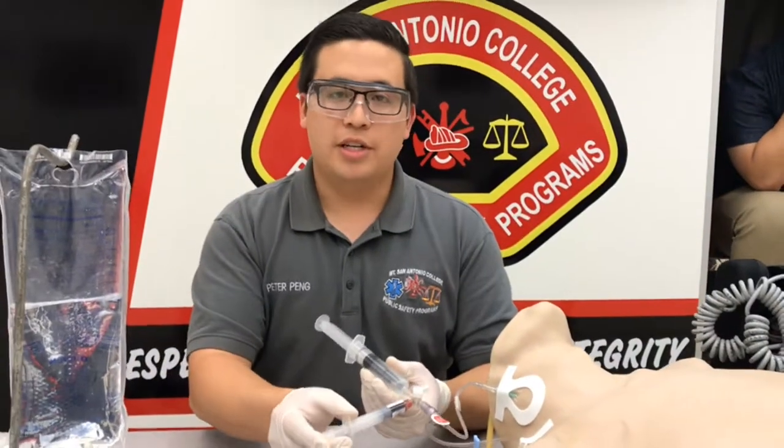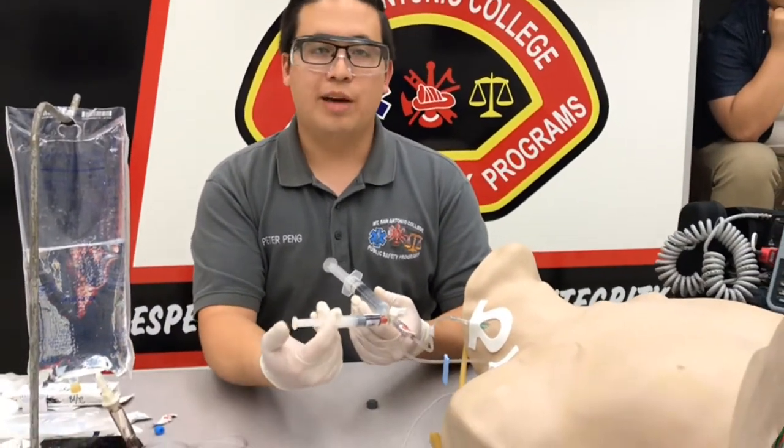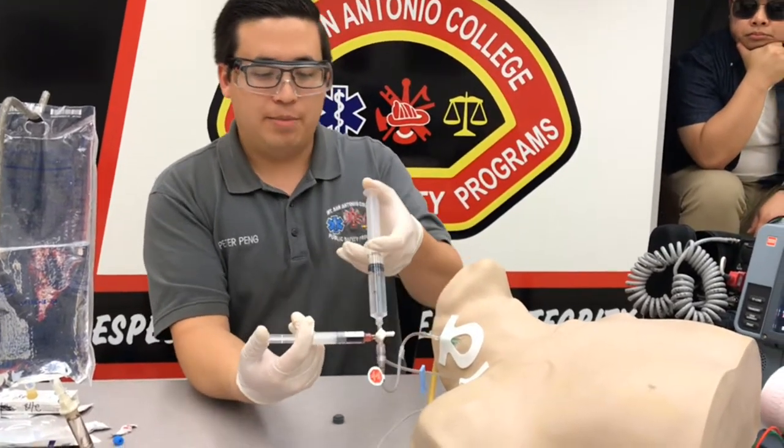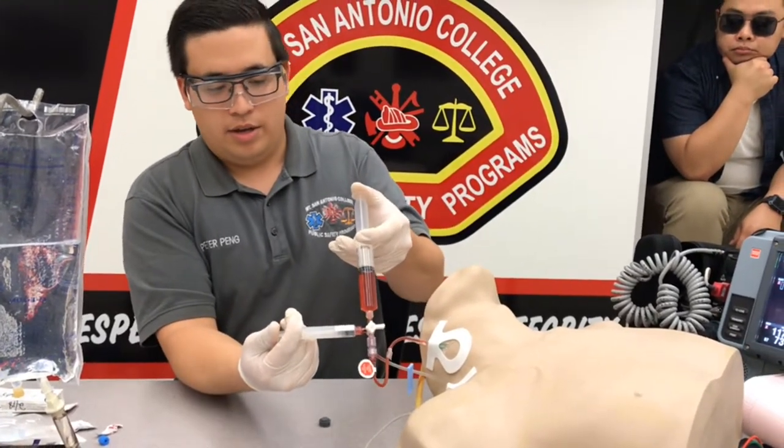What we're going to do here is push the adenosine quickly. I'm going to hold that plunger down because of the pressure, and then flush with this syringe — push rapid, and flush.